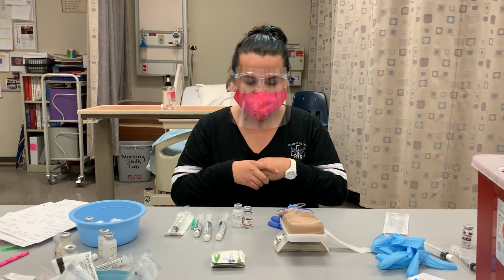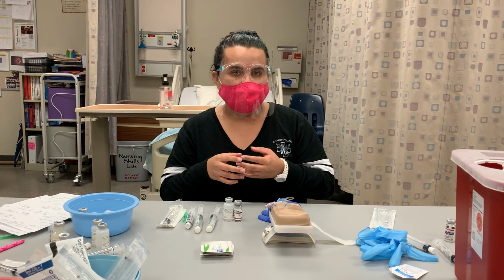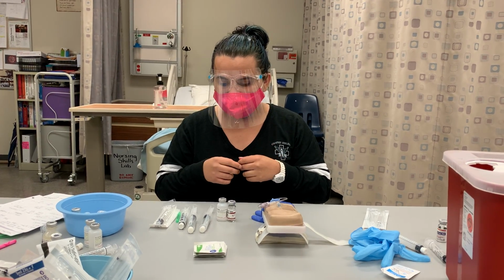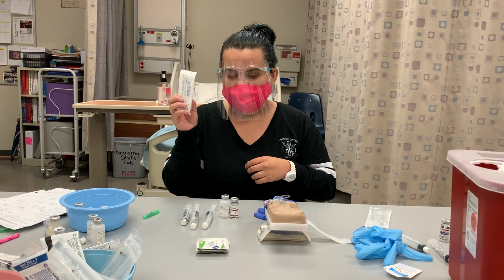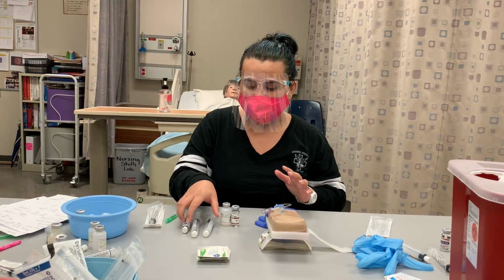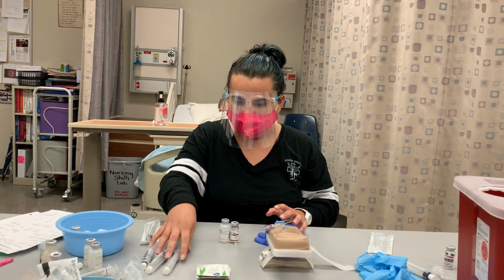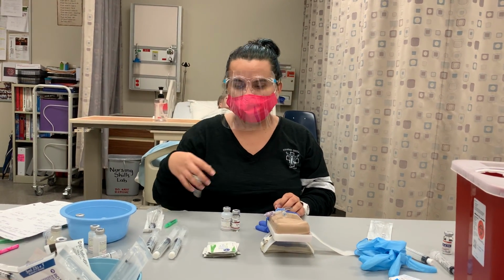So what I'm going to do is go into my med room and do my 2 checks in the med room with my medication. I am going to be grabbing my supplies. I will need my syringe that I will be diluting my morphine with my normal saline. I'm also going to grab 3 flushes to take into the room, and of course have alcohol swabs with me.